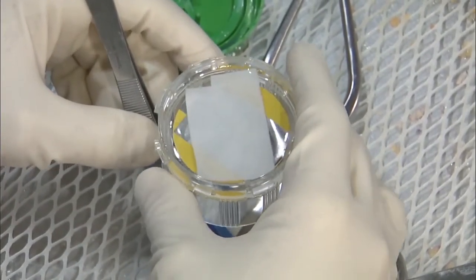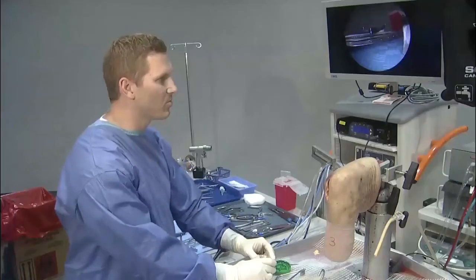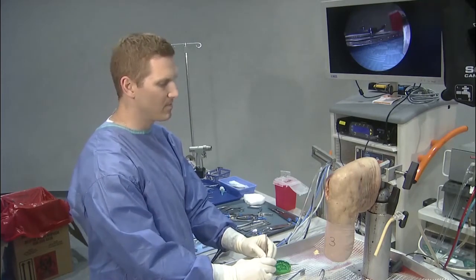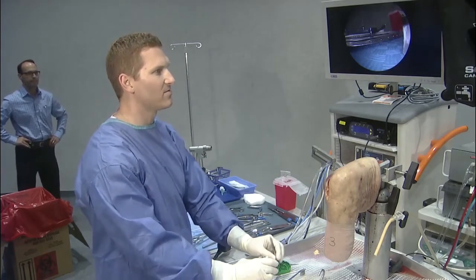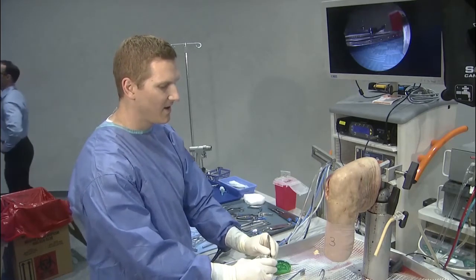Yeah, that's great. And then can you talk a little bit more about the timing from the biopsy? I know you said the fastest it can happen, but what if the patient's not ready, or how do you make that decision of when you're going to move forward with implantation? Yeah, so logistically, we'll perform the arthroscopy, and then you'll get an initial notice from Vericel basically on how your harvest was. So they'll actually give you a weight of your harvest, which is great. If you have a low weight, less than 200 milligrams, they will let you know, so they'll give you that feedback.